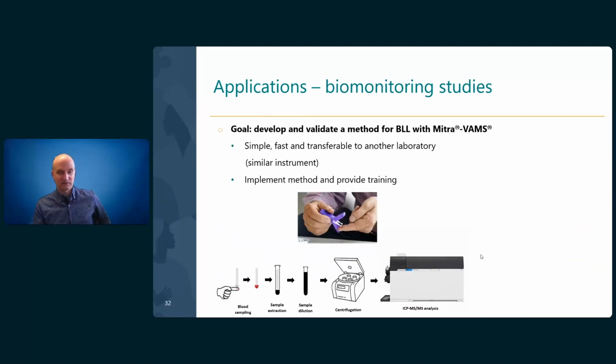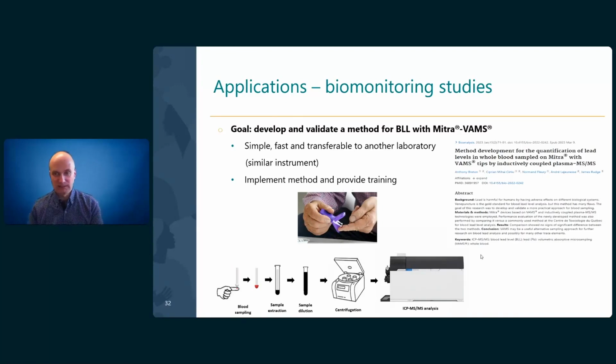So for that reason, we needed to develop different methods. First, a simple method, transferable to another laboratory, obviously on the same instrument or a similar one. And for that reason, we started working specifically on lead. We developed and validated the method, and then we implemented it in their laboratory, and we provided training to the team. That work was published in 2023, and the method is now running in the laboratory.